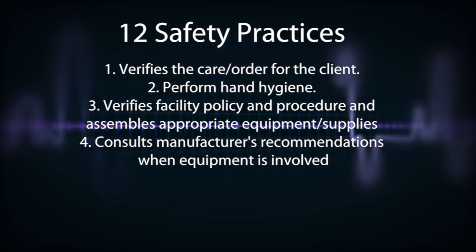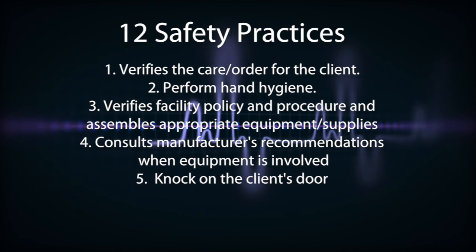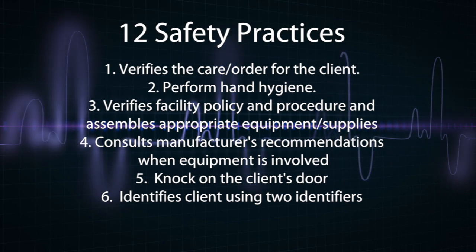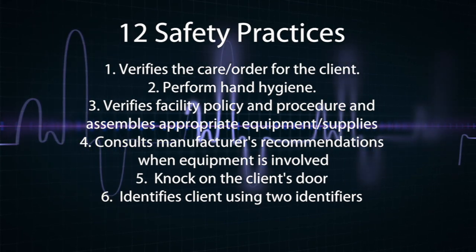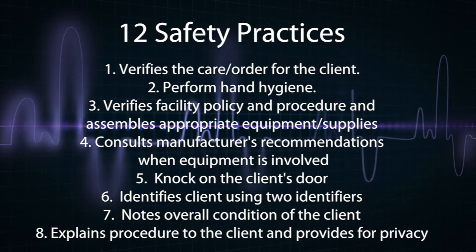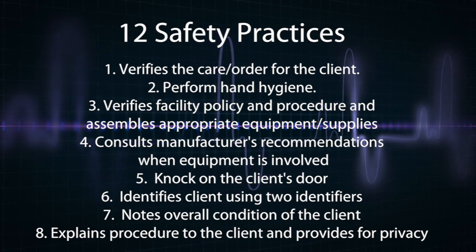4, consults manufacturer's recommendation when equipment is involved. 5, knock on the client's door. 6, identifies client using 2 identifiers. 7, notes overall condition of the client. 8, explains the procedure to the client and provides for privacy.